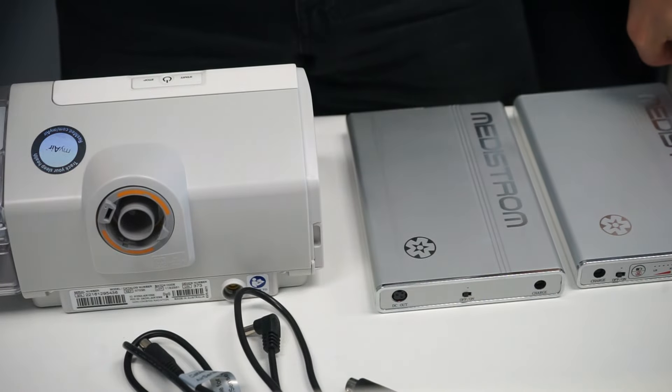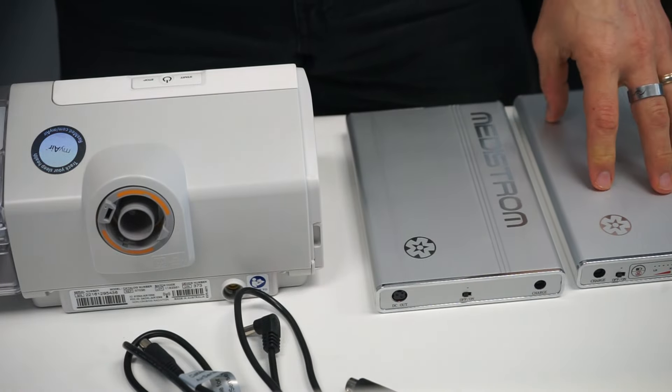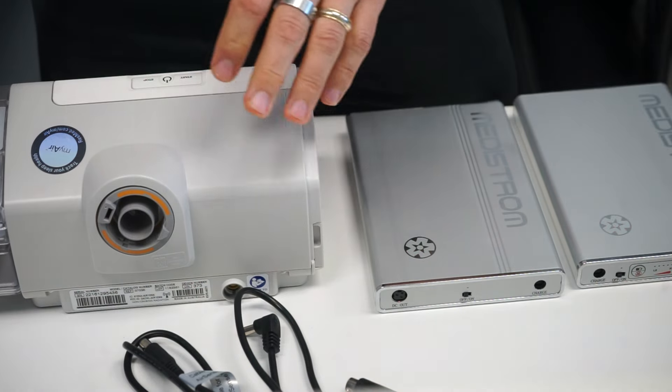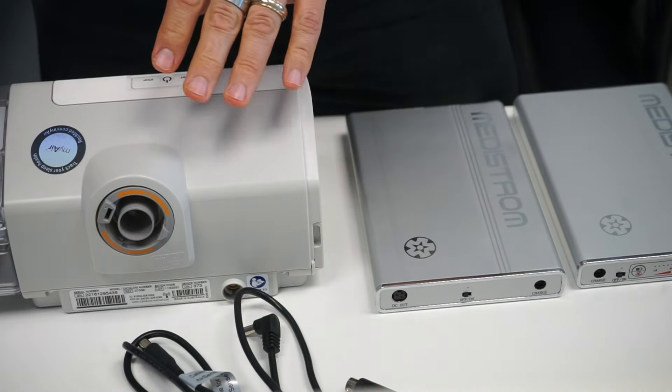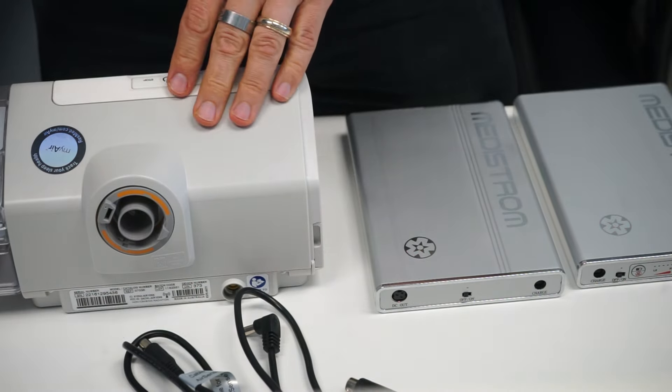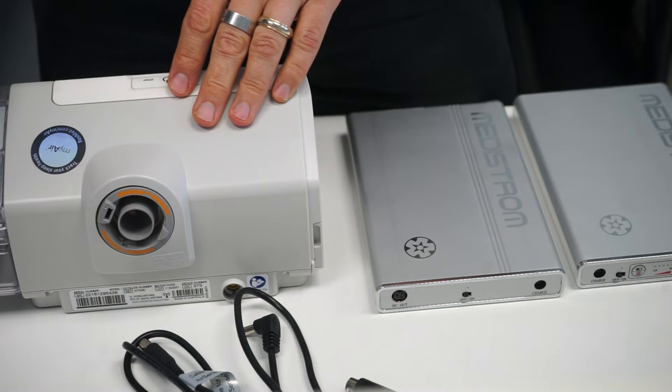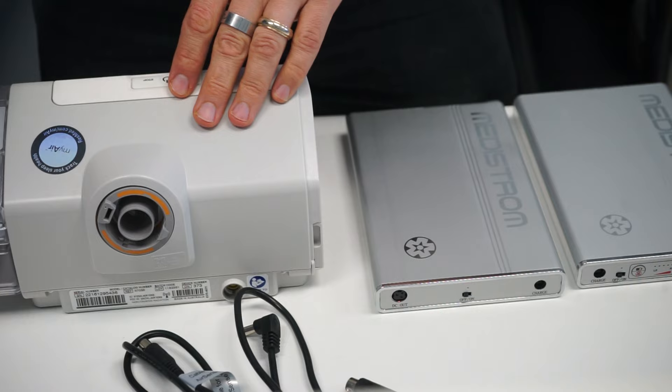Today we're going to quickly cover the Pilot 24, the Co-Pilot 24, and how they will power the ResMed AirSense 10 series as a CPAP, an APAP, or a BiPAP.